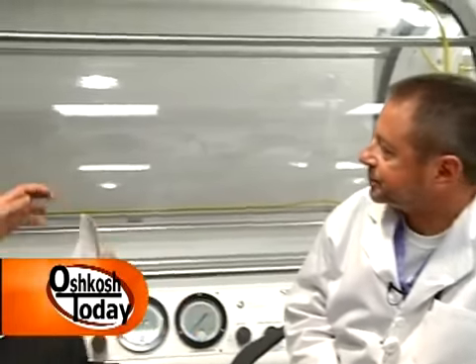Well, and I look at this, it's a big, imposing machine that patients see when they come in. When a patient is in a unit like this, what are they feeling? They're feeling increased pressure. Usually they'll feel it in their sinuses and sometimes in their ears. If you've ever been up in altitude in an airplane and felt your ears pop, it's a very similar sensation.